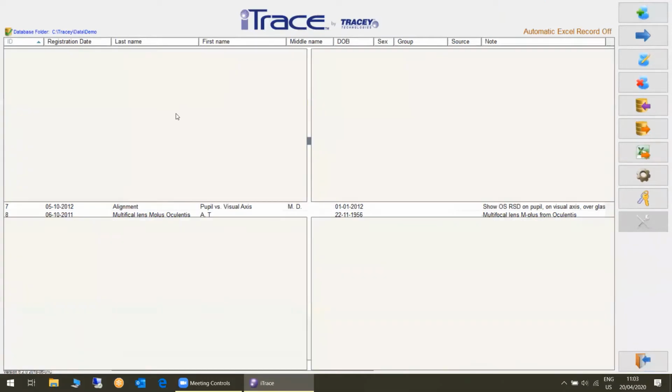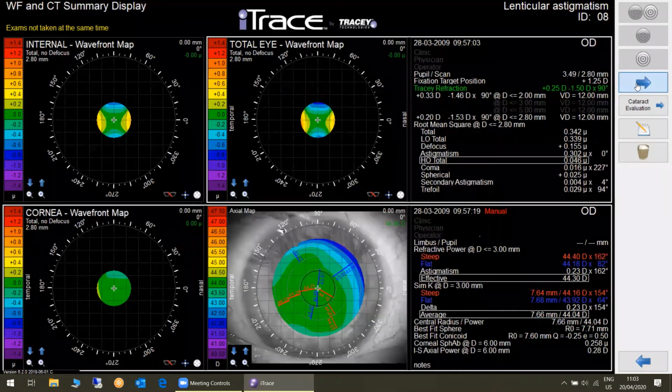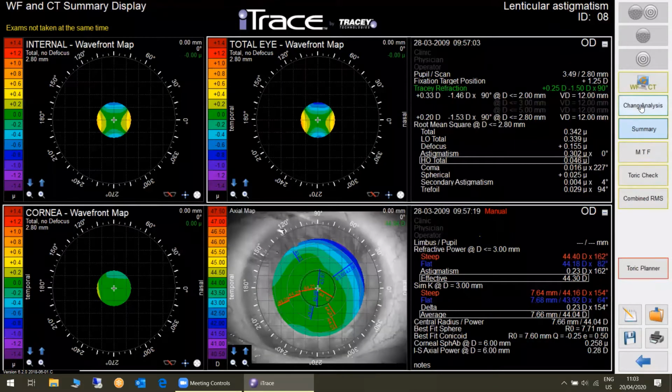We know that if the patient needs to perform cataract surgery, we need to correct with toric IOL this kind of patient, because we know that at the end of the surgery with a monofocal non-toric, this patient will have an against the rule astigmatism for the homocentric condition of the wavefront corneal and for the physiological tilt of the IOL at the end of the surgery. But this cornea has no astigmatism whatsoever.